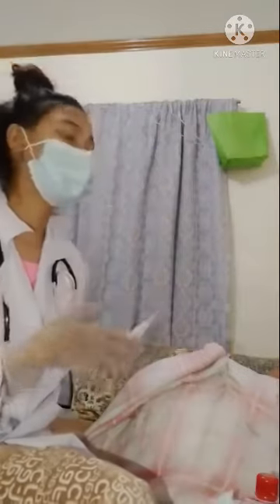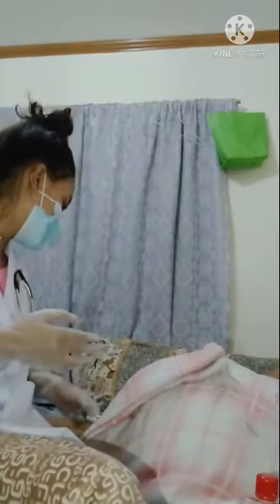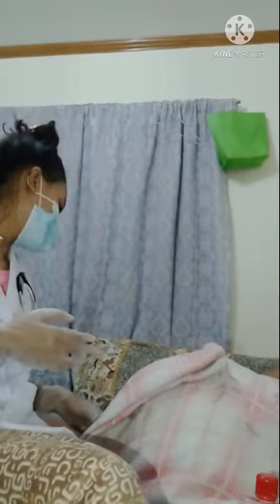And then after that, separate the buttocks to make the anal sphincter visible. And then after that, insert the rectal thermometer into the anus of the patient. If the patient is an adult, 1.5 inches only, while if your patient is a child, 1 inch only. And then we can now insert the thermometer.